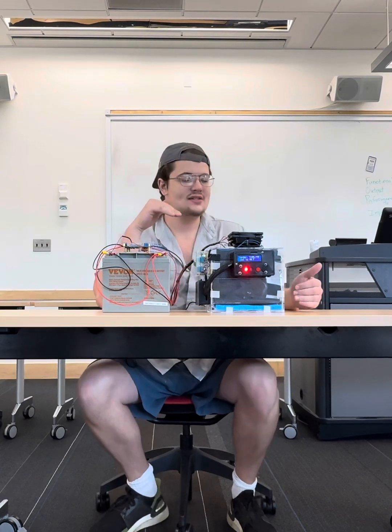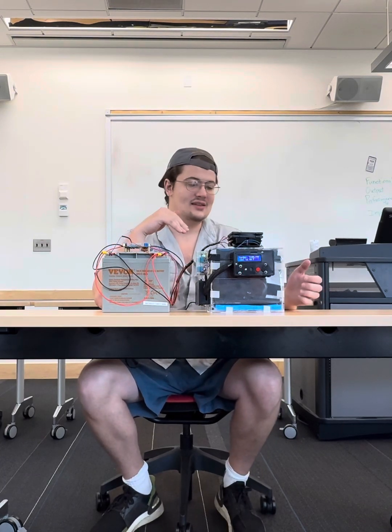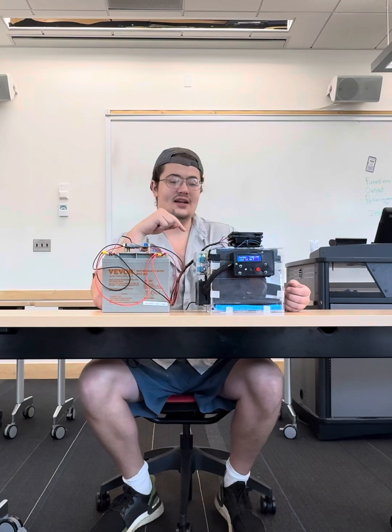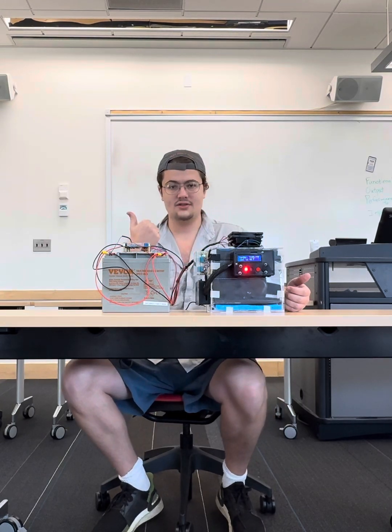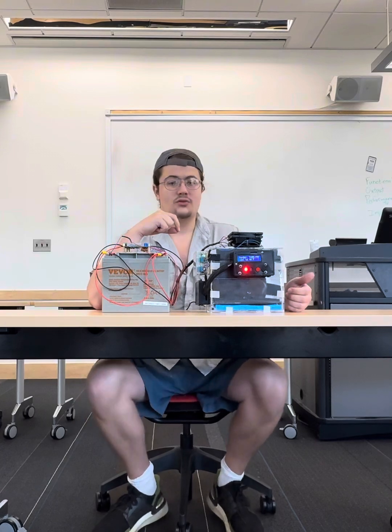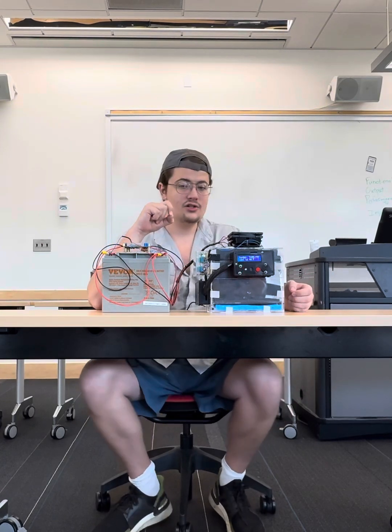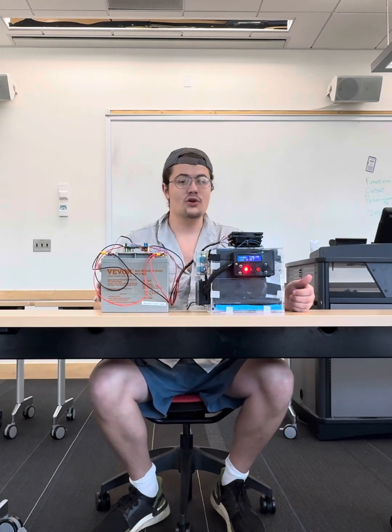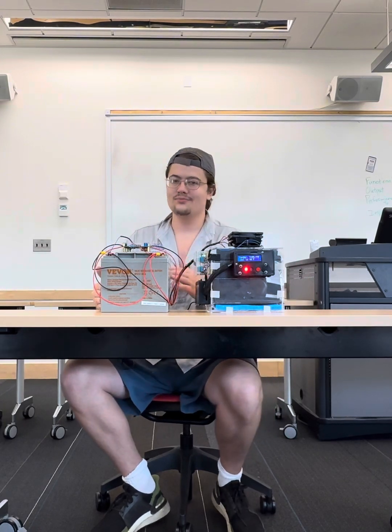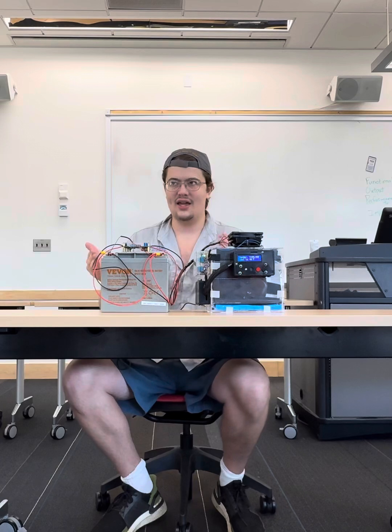The box is comprised of polystyrene insulation and this nice acrylic finish. Inside the box is a Peltier device which transports the heat from inside the box outside the box. In order to make this project work, we need to maintain a temperature of less than 32 degrees Fahrenheit for 24 hours. Now, this battery can almost do that. It can achieve the temperature, but not for as long as we need it. If only we had some more money.